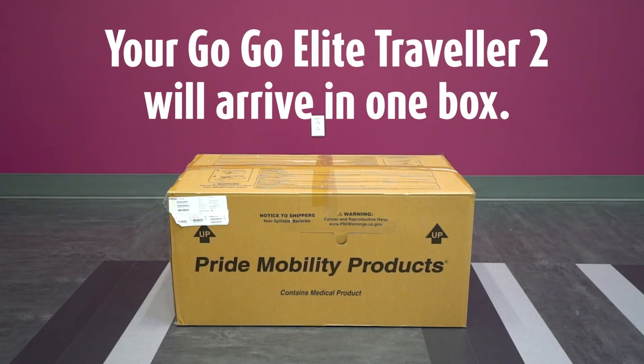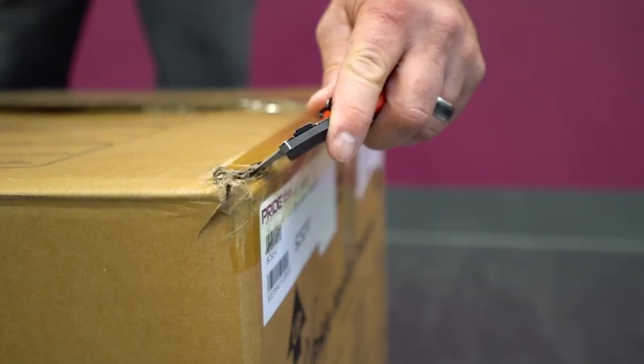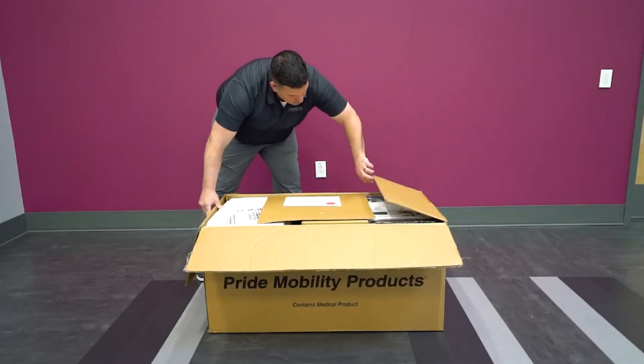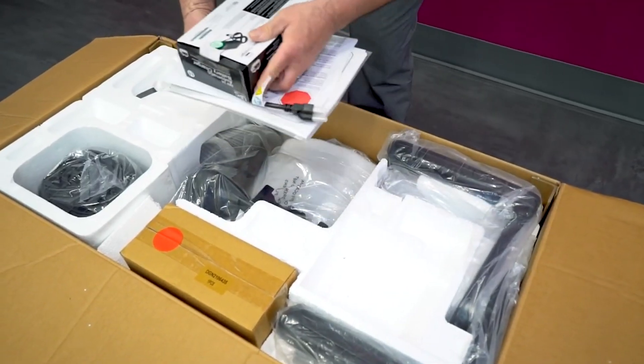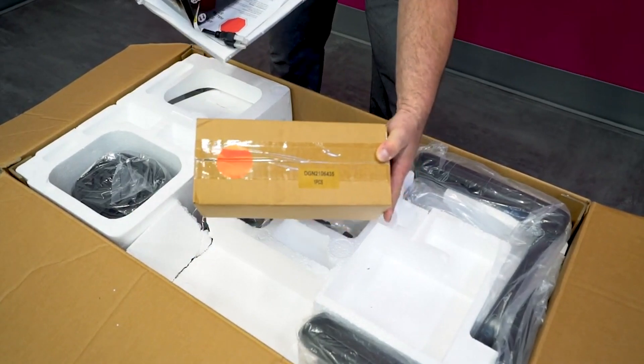Your GoGo Elite Traveler 2 will arrive in one box. Start by using a box cutter to cut through the tape and open the box. The contents should be packaged as seen here. Remove the battery charger, manual, and this smaller box with a sticker to set aside, which contains your alternate shrouding.